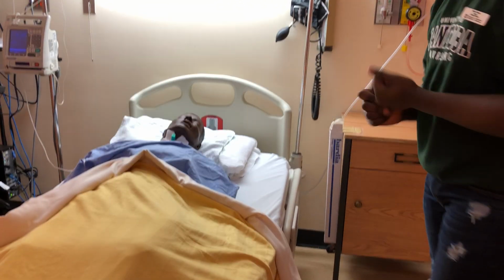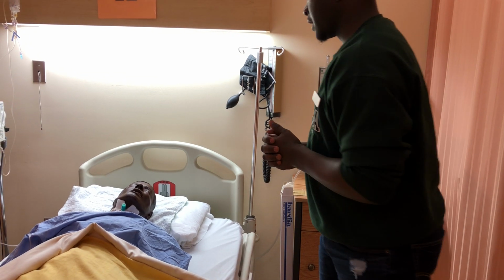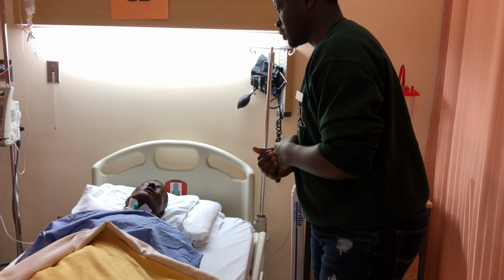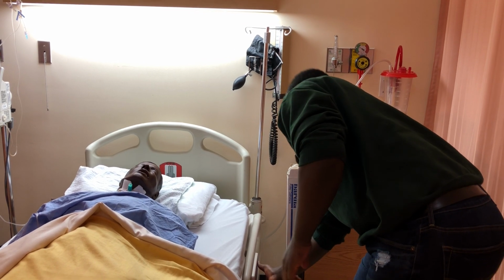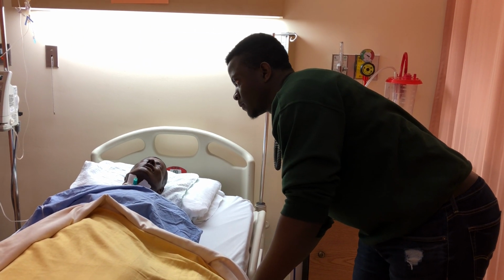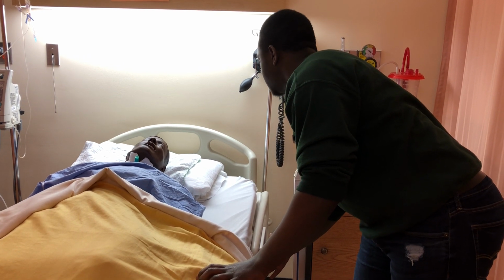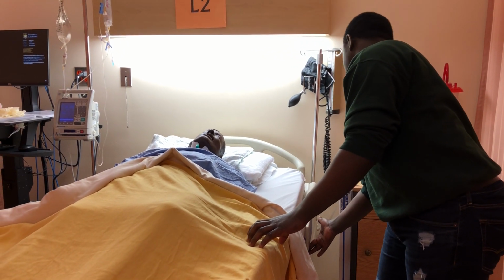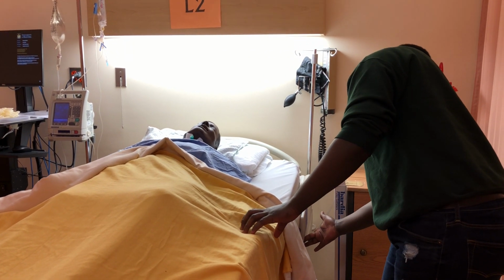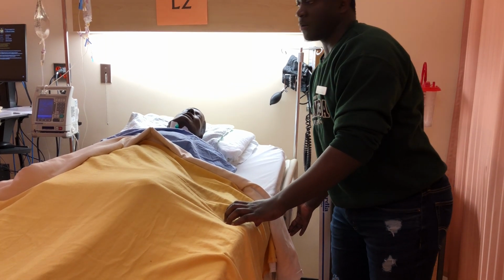So I'll first put the bed up to my waist level and introduce myself to the patient. Hi, my name is Valdo, I'm a student nurse and I'm going to be changing your chest tube dressing, okay? So I'm just going to put up your bed here, okay? I'll check the suction pressure nearby, in case. And then I'll raise the head of the bed a little bit.